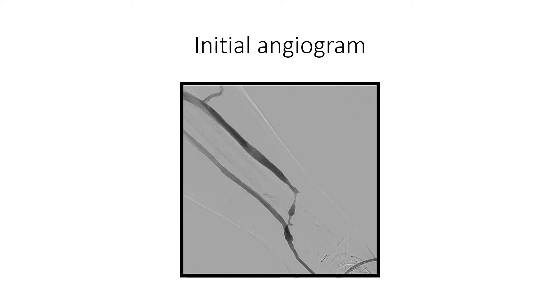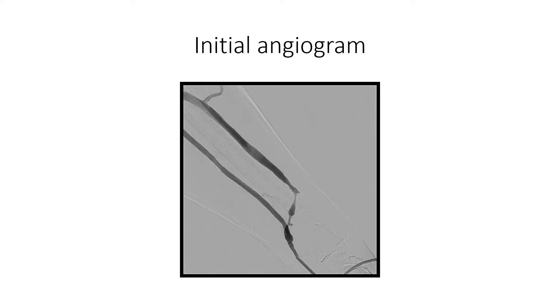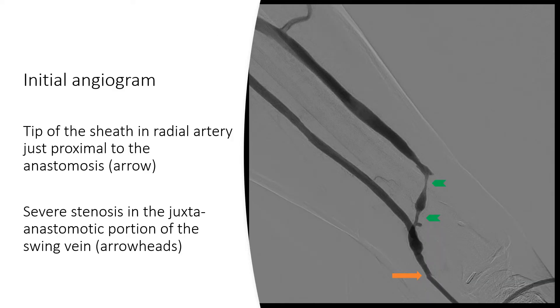Our initial angiogram looked like this. We can see the contrast filling the radial artery as well as the vein, and you can see the stenosis in the swing vein section. The orange arrow here points to the tip of the sheath and the green arrows point to the stenosis in the juxta-anastomotic portion of the swing vein.